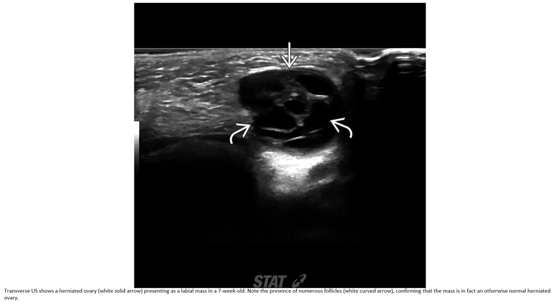This is an ultrasound of a herniated ovary presenting as a labial mass in a seven-week-old infant. Note the presence of numerous follicles, confirming that the mass is in fact ovarian tissue — a herniated ovary.